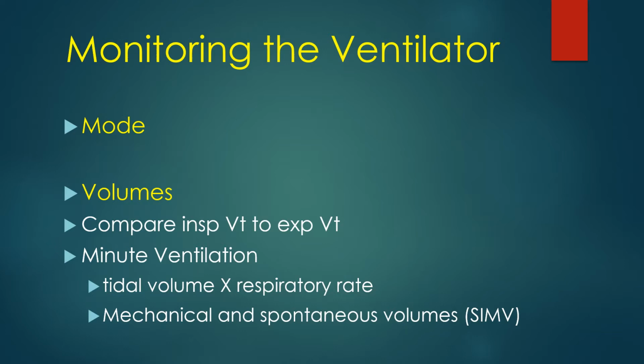What would it mean if you saw that the patient was inspiring 500 and exhaling 600, and he's doing that every breath? That would be kind of a difficult thing to do unless the patient is manufacturing air in his lungs. You can't continuously exhale more than you inhale. That's not a common one, but you may see that, and that usually is a problem with the ventilator. The inspired tidal volume is probably accurate because that's on the dry side of the ventilator. The inspiratory side of the ventilator, there's no moisture in there.